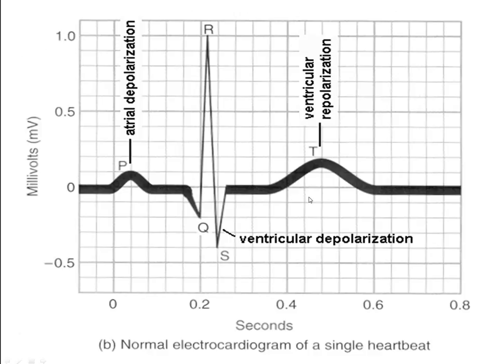So the question is then, if we see the ventricular depolarization and repolarization, why don't we see the atria repolarizing? What wave is that? The answer to that is a little bit of a trick, because where would it occur? If you're thinking of this line, where would it occur? That's right in this area here. And we can't see it because this massive amount of myocardial muscle is depolarizing, and it hides whatever would be showing up from the atria. So it's hidden.